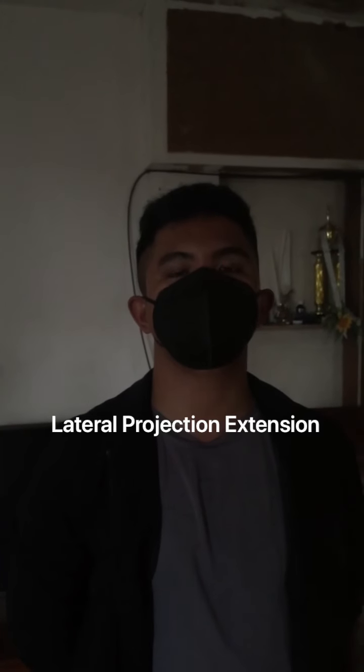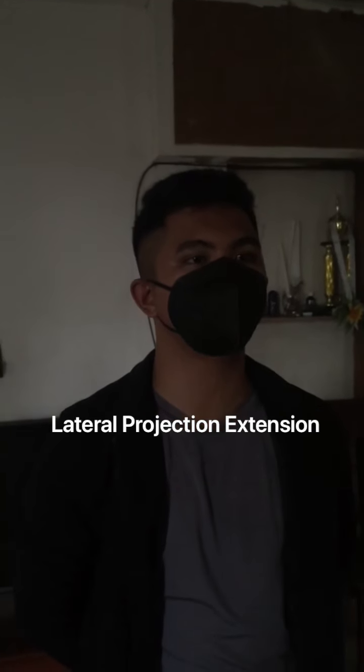Lateral projection, extension. An alternative to the fan lateral for localization of foreign bodies of the hand and fingers. Image receptor size is 8 by 10 inches lengthwise. Patient position: sit the patient at the end of the table with elbow flexed about 90 degrees and forearm resting on the table.